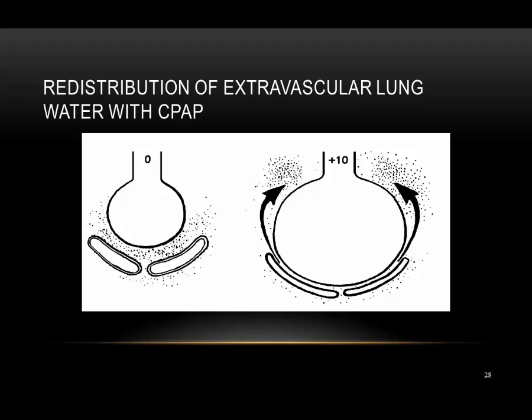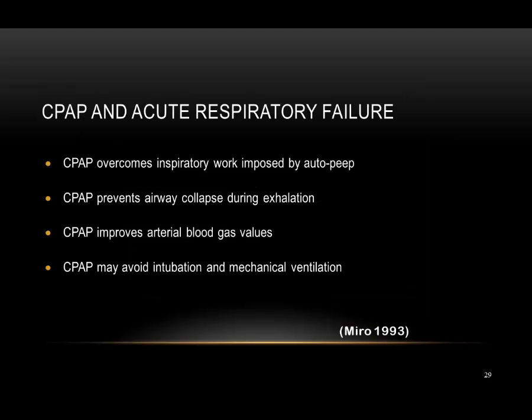This redistribution of interstitial water improves oxygenation, lung compliance, and the ventilation perfusion matching when applied in either cardiogenic or non-cardiogenic pulmonary edema.